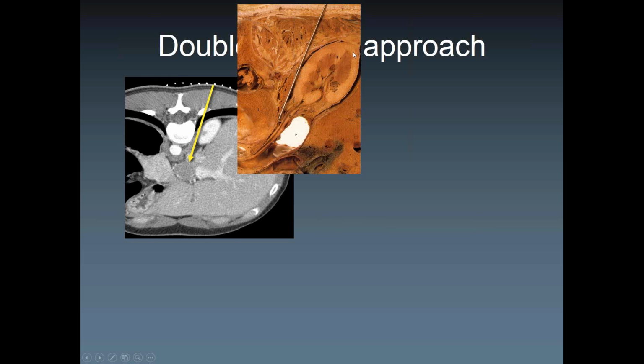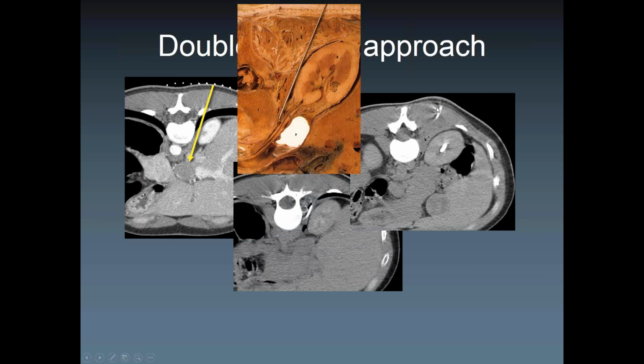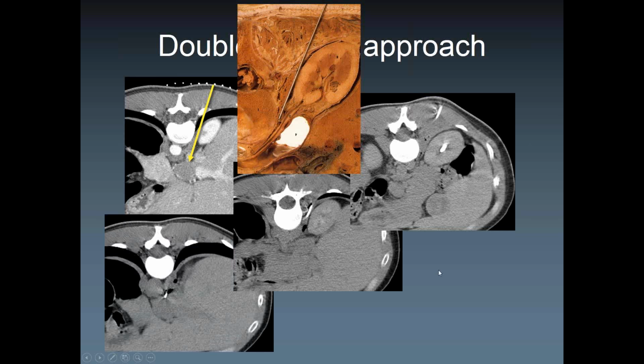The kidney is very vascular, right? So you can skim it with the Hawkins needle, for example, or just go with an introducer only in some sections without the inner stylet exposed, so that gives you a blunt tip as well. You can basically scratch along the kidney surface and navigate the needle to the target area. That's usually pretty safely done. And then you have to basically plan the approach across several transverse images. That's the art here. So you have to basically plan the approach with an angulation in the z-axis. So this is what it would look like. Here's a needle in the most superficial layers. A little deeper down, it's right here just past the pleural space, which is like the tricky part to do.